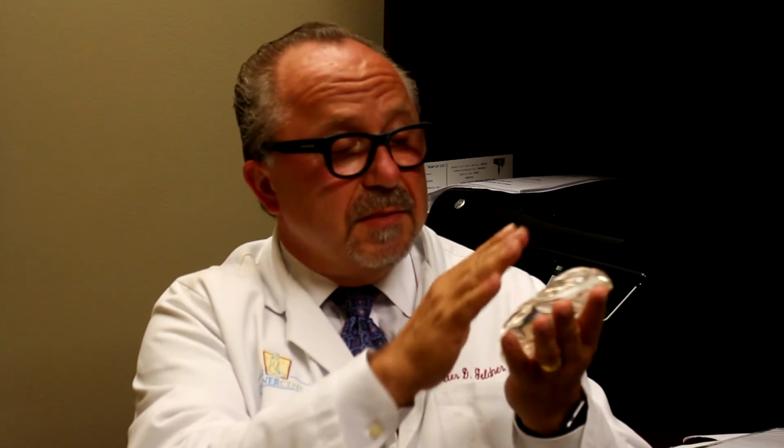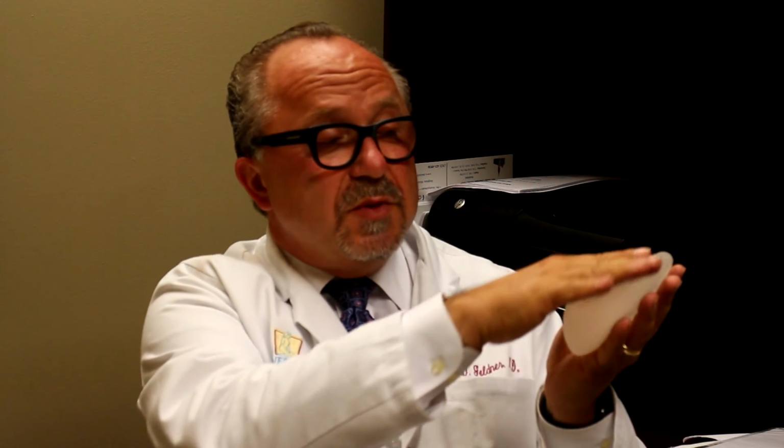So, when do I use this kind of an implant? In the ideal patient who's just looking for a little bit of volume but otherwise has a great result, when do I use this kind of an implant? In cases where the patient wants it, in cases where I'm trying to create the shape, and then the third situation where I really need to have the smoothness at the top so that we eliminate irregularities.